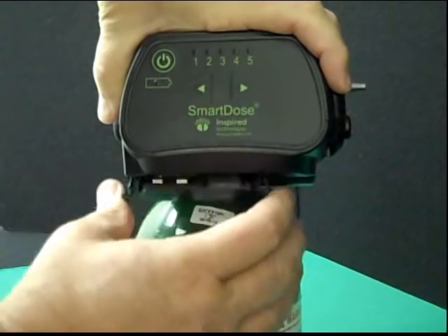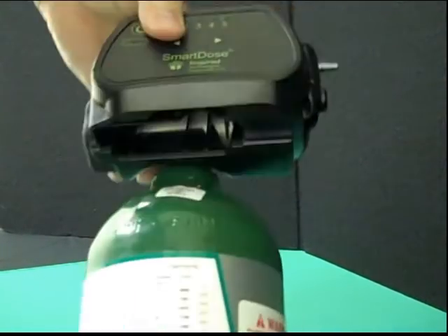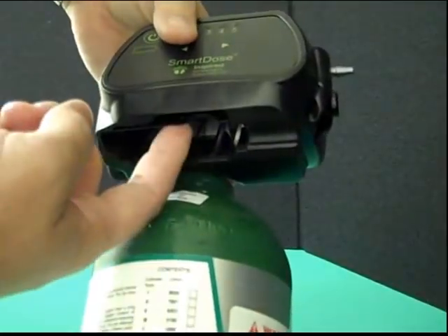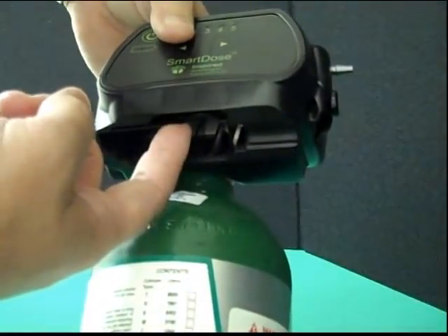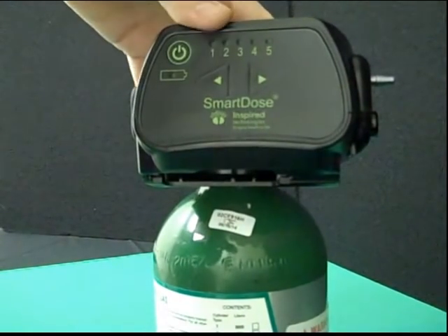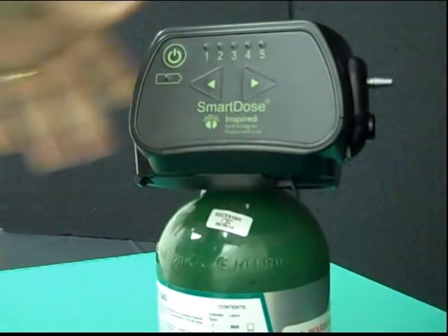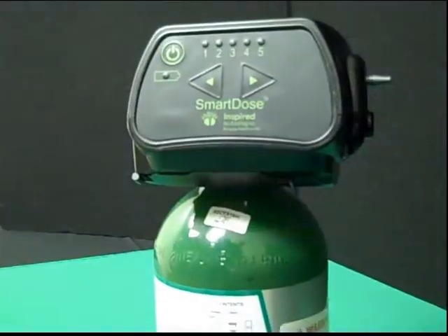Each SmartDose unit can write breath-by-breath data to an SD card. To insert a card, simply remove the batteries and holder and place the SD card into the card slot. Push to seat and it's ready to write data. To remove the card, simply push again and release the card to unseat it, then remove for reading. This is exactly like SD cards used in digital cameras.